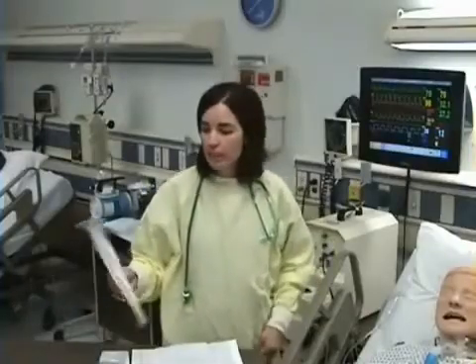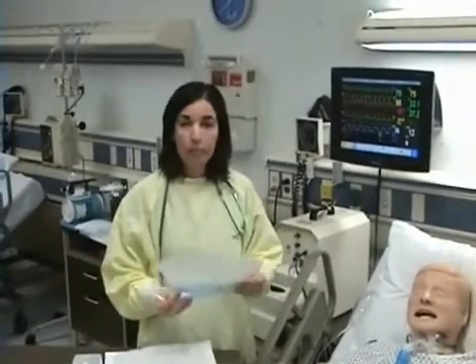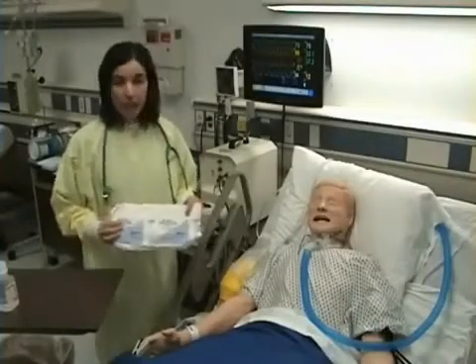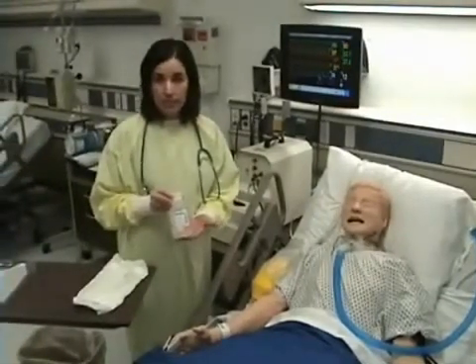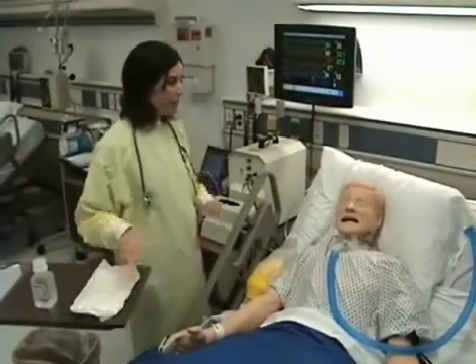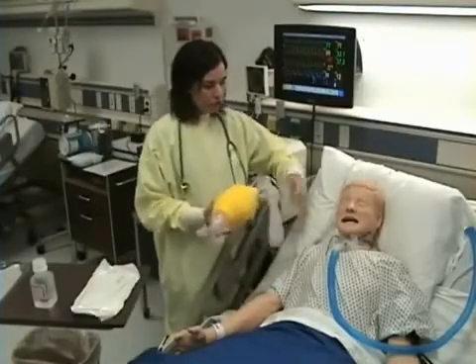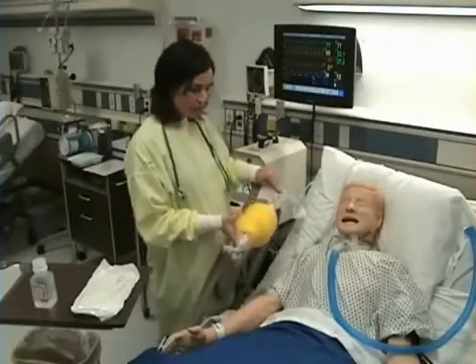For demonstration purposes, so that you can hear me, I am not going to be wearing my mask with my face shield. The supplies that I will need for this procedure are a suction catheter kit and a bottle of normal saline. My sterile gloves are in my kit, but I also will need non-sterile gloves. I also need an ambu bag. The ambu bag administers 100% oxygen as well as ventilations to my patient.